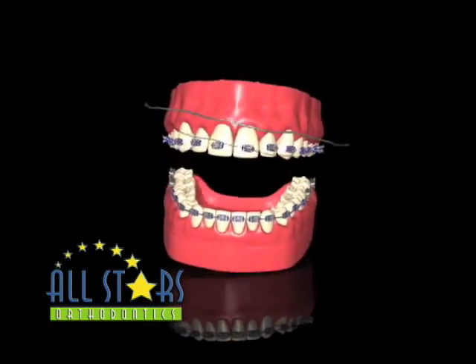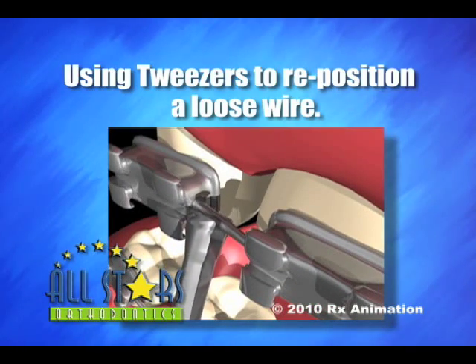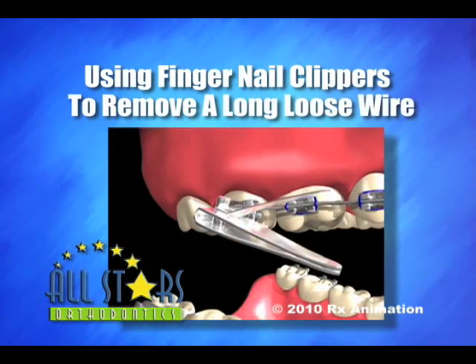Please don't remove your entire wire. Using the above directions, you can solve the problem while still allowing your teeth to continue their alignment.